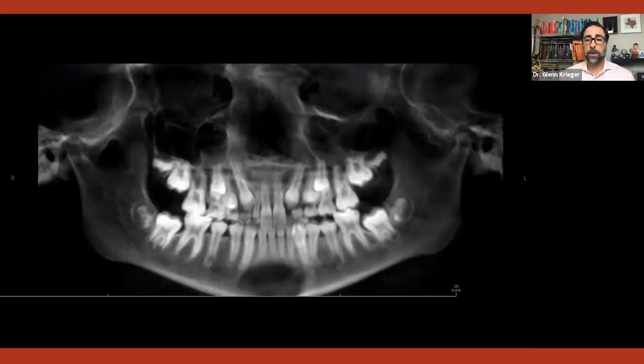We always look for these sort of oddities when we're missing a tooth. Her upper left cuspid is erupting into the central incisor. She's got some crowding of the lower arch, crowding of the upper arch. So, again, I wouldn't look at this case and say, oh my gosh, what a difficult case. But certainly there are going to be decisions that have to be made in terms of diagnosis, right? Remember, diagnosis, that's the name of the game here.